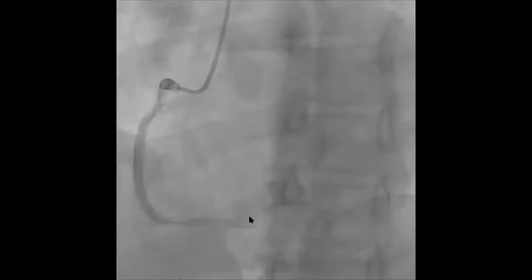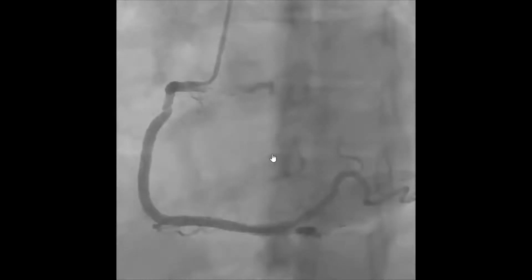Now, the catheter is pointed to the left of the screen, so it's pointing this way, to the left of the screen, right? And it mostly is occupying the left upper side of the screen. The vertebral column, you can see it in the background here. And the rib cage is inclined this way.